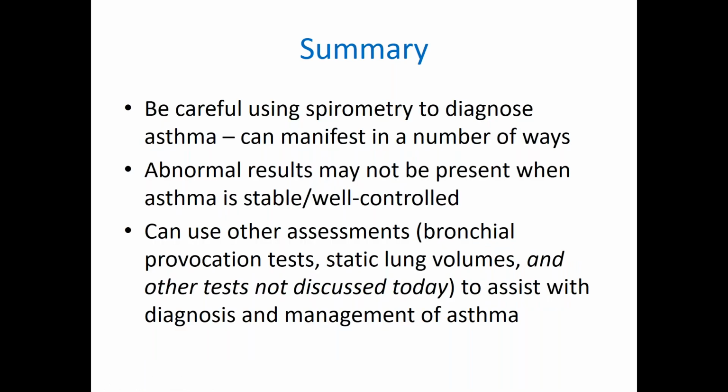So in summary, be careful using spirometry to diagnose asthma. It can manifest in a number of ways, and you can miss it if you're not thinking about the clinical picture and the symptoms at the same time as you're looking at the results.